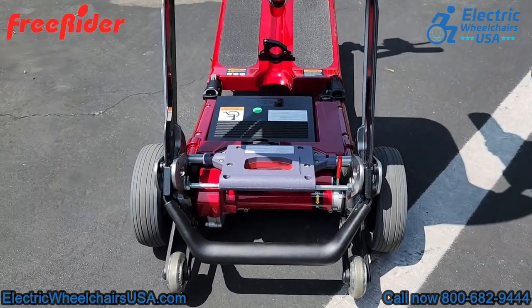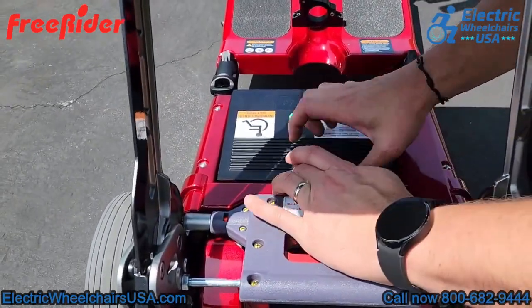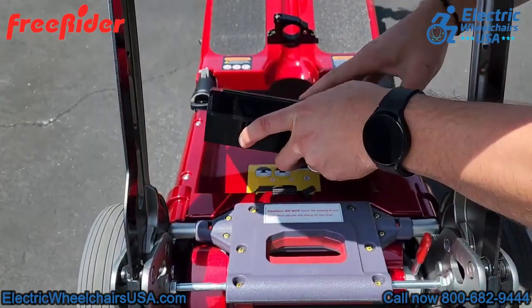This is where your battery is located. To remove the battery, it's real simple — you just press this button and the battery comes right out. There are two ways to charge the battery and we'll show you how to do that in just a moment.